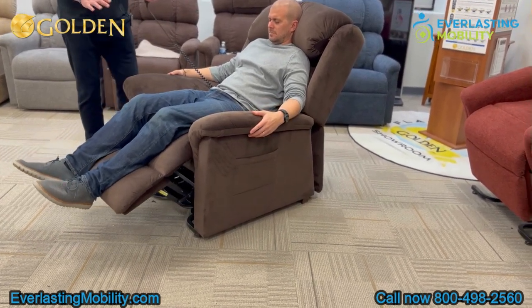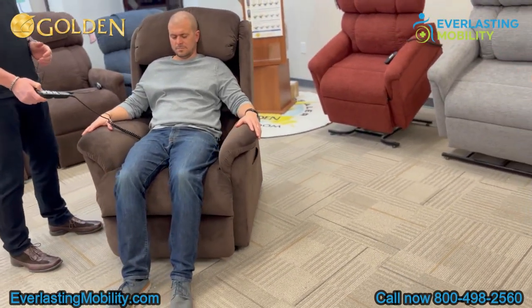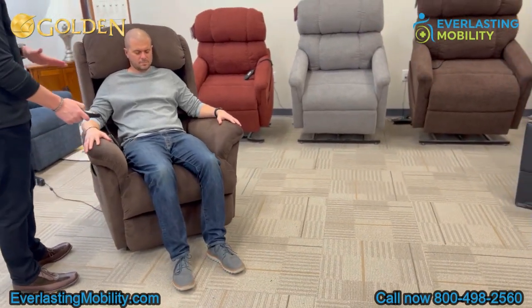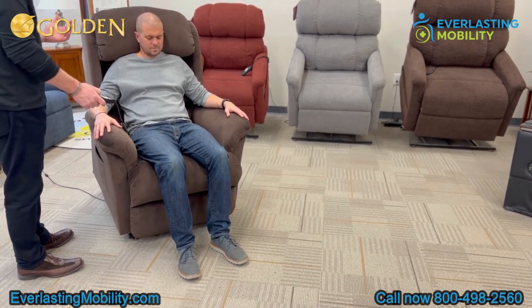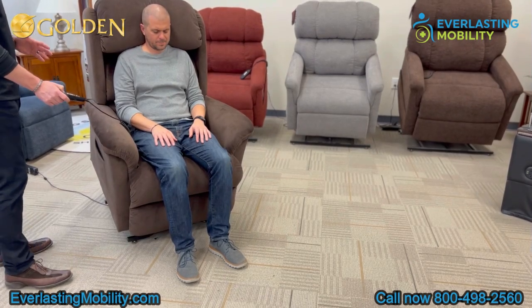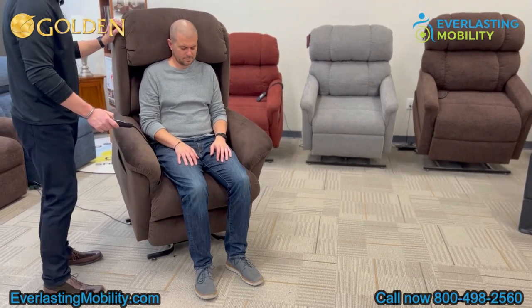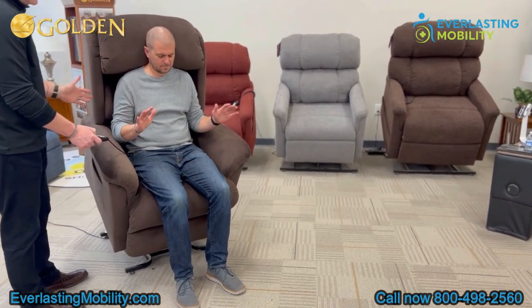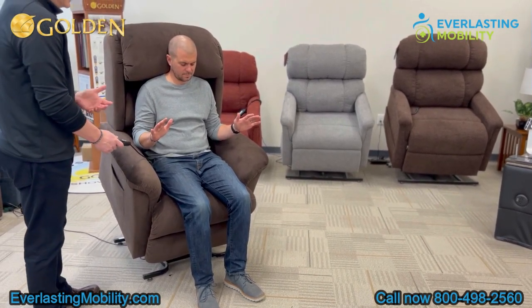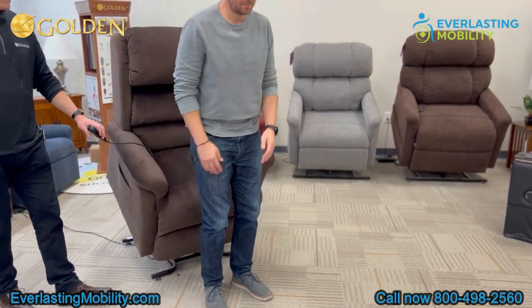To exit the chair, you can just press one button — it operates both motors at the same time and moves the chair into a lifted position. One of the great things about a Golden product is that the lifting position is not going to make you feel like you're falling out of the chair. Golden products have a very gentle lifting position — the back opens up a little bit so it doesn't feel like it's pushing you out. Once lifted, you can see he's not even holding on or engaging his quad muscles to exit. He's just comfortable, and when he's ready, all he's got to do is press his hands down and walk forward.